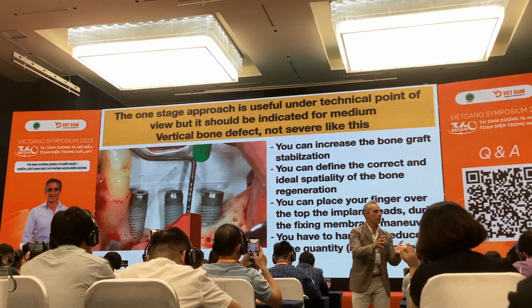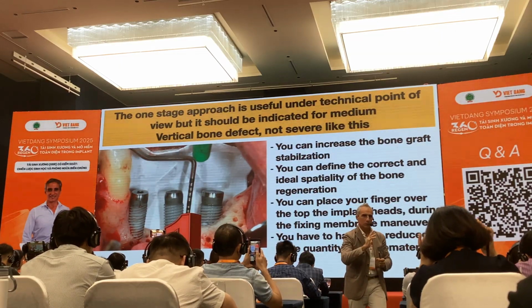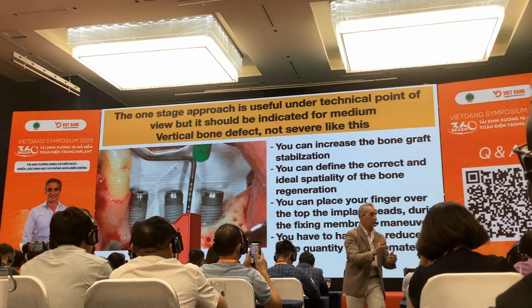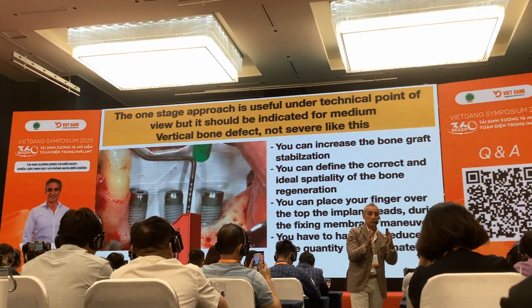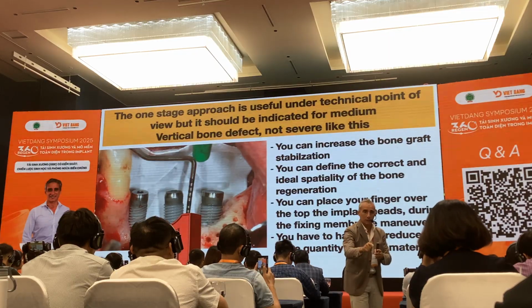If you place the bone more buccally, the buccinator muscle remodels it, and you have big absorption in a horizontal way. And if you place the implants in the middle of your regenerated bone, but too buccally, step by step, remodeling, exposure of the implants, peri-implantitis.